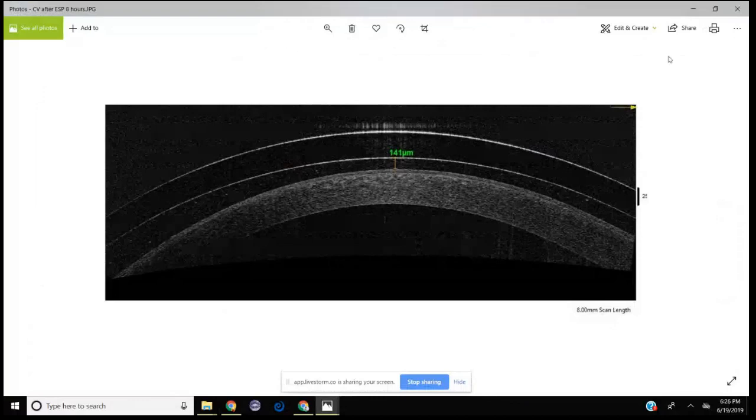Sorry, Brad, one more question. So between settling and flattening the haptics out, you would expect to see a 160, 159 micron drop. Correct. Some conjunctivas I find are very squishy, I can get up to 200 or more. If I have a younger patient with a more taut conj, sometimes I get less than 100 of settling. So the average I would say is about 150. And the Eaglet kind of nailed that. With the 500 initial lens, drop that down 200. I expect 300 initially. This lens then technically settled 160 microns after 8 hours.